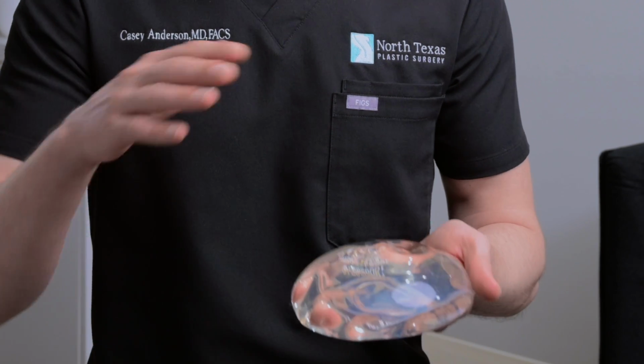First of all, unlike the saline, you're not going to see a big volume difference. The breast isn't going to deflate. But what may happen is it may just feel different. Sometimes patients will say it feels just slightly softer or just feels different. But since it's not going anywhere, how do we determine this? So generally what will happen is I'll see you in clinic, we'll get an idea that we think something's going wrong, and we'll get some sort of ultrasound or MRI tests to further determine if the shell of the implant is intact.